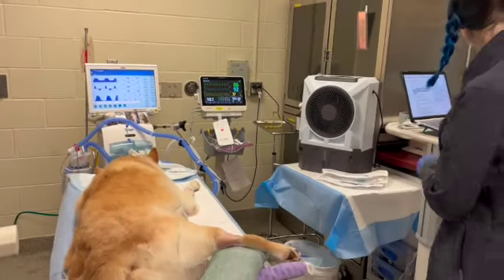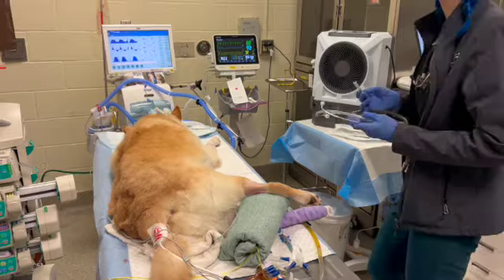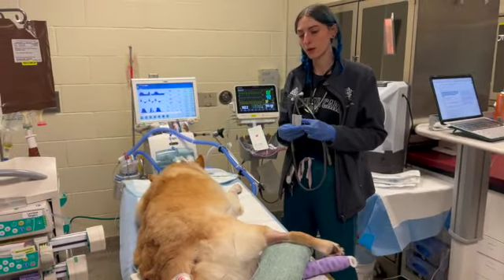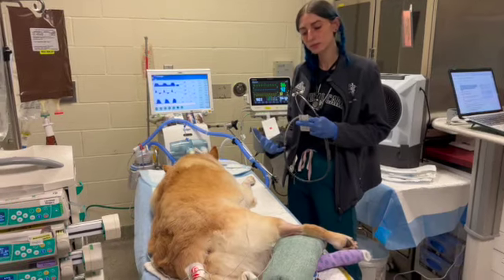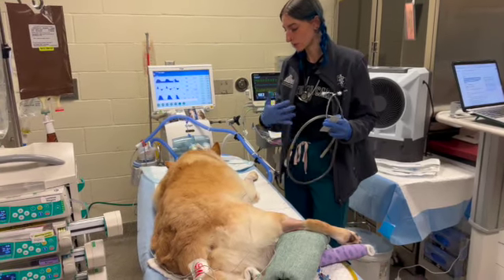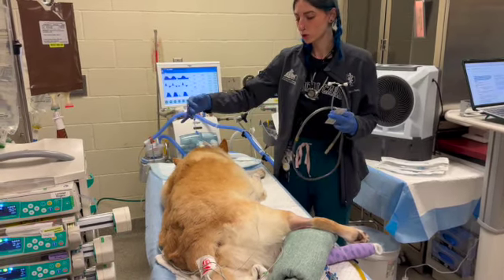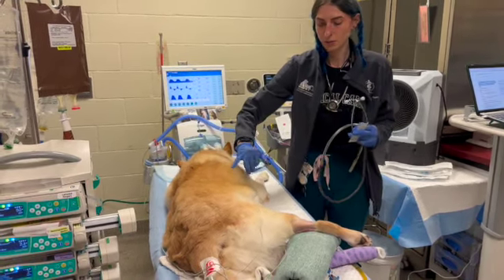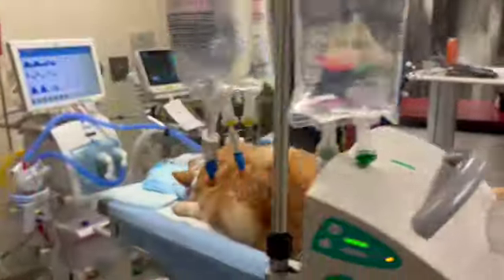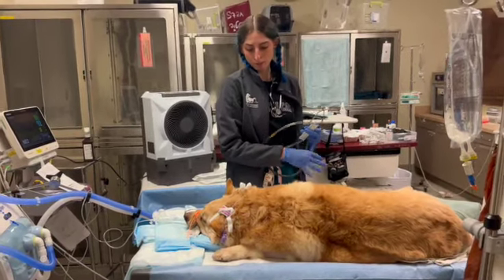And then for our last thing, for this patient, we're just going to utilize an esophageal stethoscope, and we're going to pass that through the esophagus so that way we can hear our heart and lung sounds. One of the other things that you could do is also pass a gastric tube. For the gastric tubes, you're going to want to pass them to the stomach, and that's typically to either get maybe some air out of the stomach or any kind of gastric contents to help empty it out.